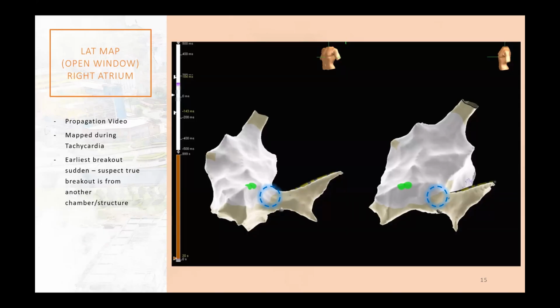Okay. And how about the power? So with non-irrigated, you start at how much, and then with an irrigation catheter? With an irrigation catheter, you can start as low as 25 watts, because this pathway is, as the author mentioned, epicardial. It should be pretty close. So I think at 25 watts, it goes away. Then you watch that impedance doesn't get higher. Then you can deliver maybe up to 30. But at most 25 to 30, you can get rid of those pathways.